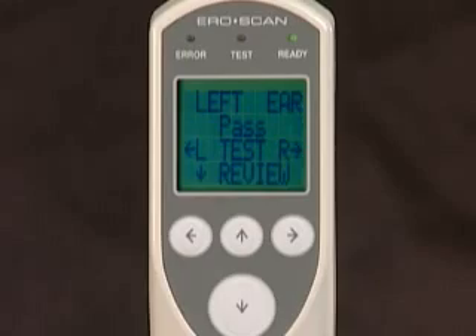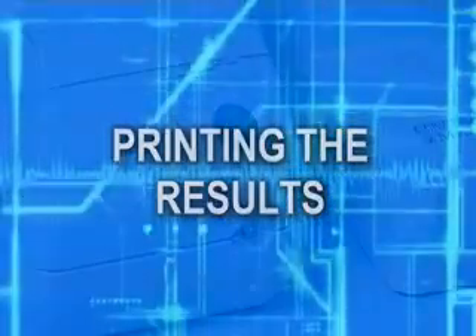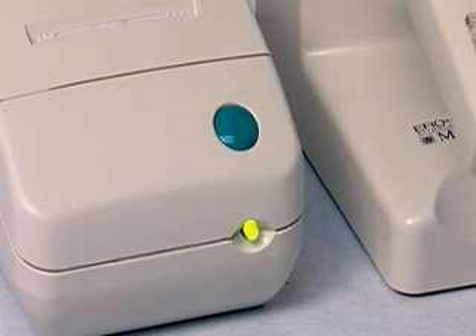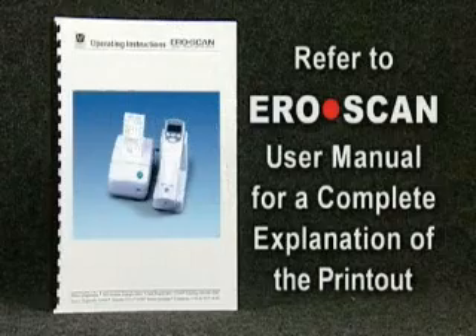Next, let's cover how to print the test results. Simply press the teal colored on button located on the front of the printer and then place the AeroScan in its cradle. The test results will print automatically. Refer to the AeroScan user manual for a complete explanation of the printout.